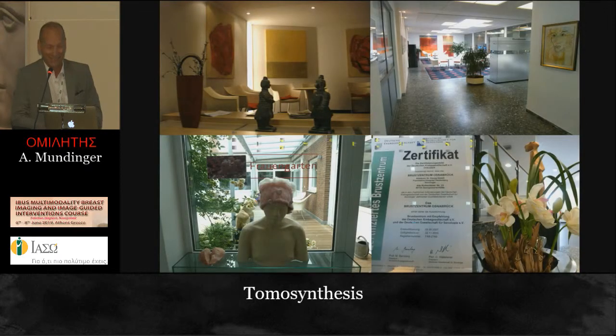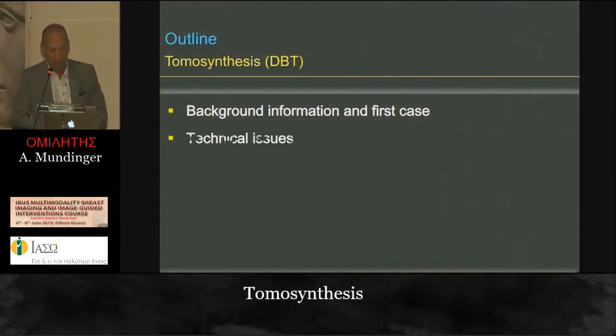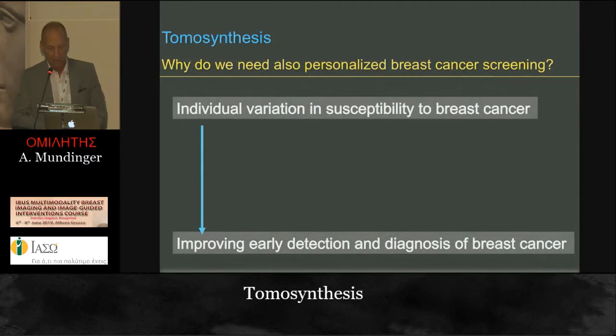So we start with a little glance at my breast center in Osnabrück, and then I give you information about the technical issues. We talk about the screening and diagnostic setting and the disadvantages, advantages, and some take-home messages. And you will hear another talk about DBT, so I split the contents a little bit and start here with the basics, and also why we should be interested in a personalized breast cancer screening, particularly important in Greece, where most of the screening is personalized.